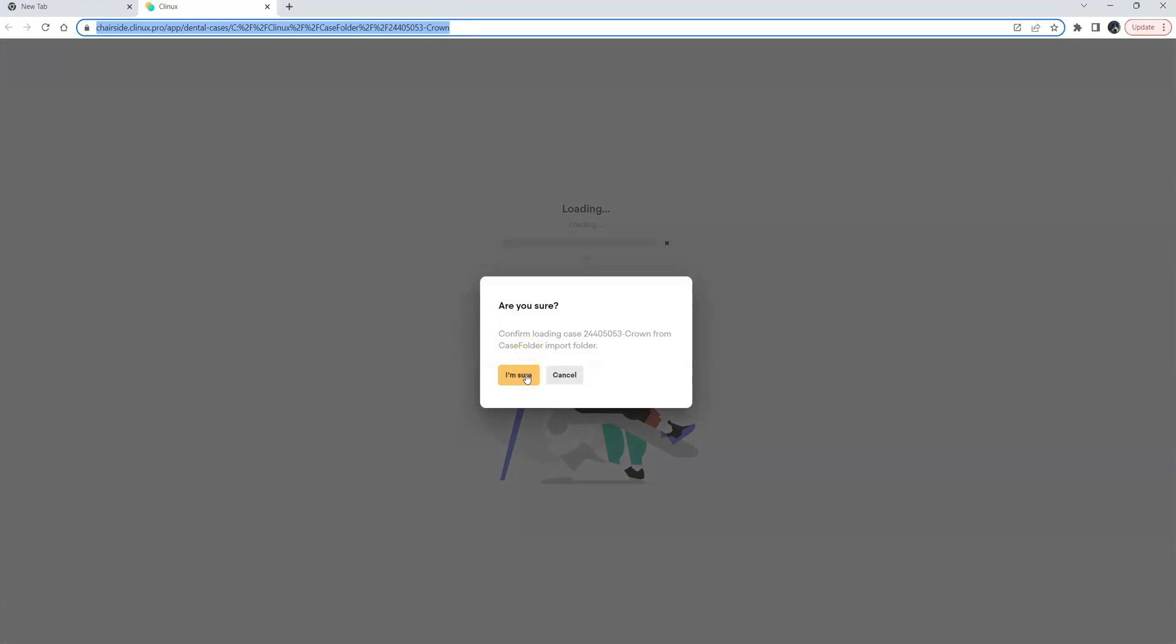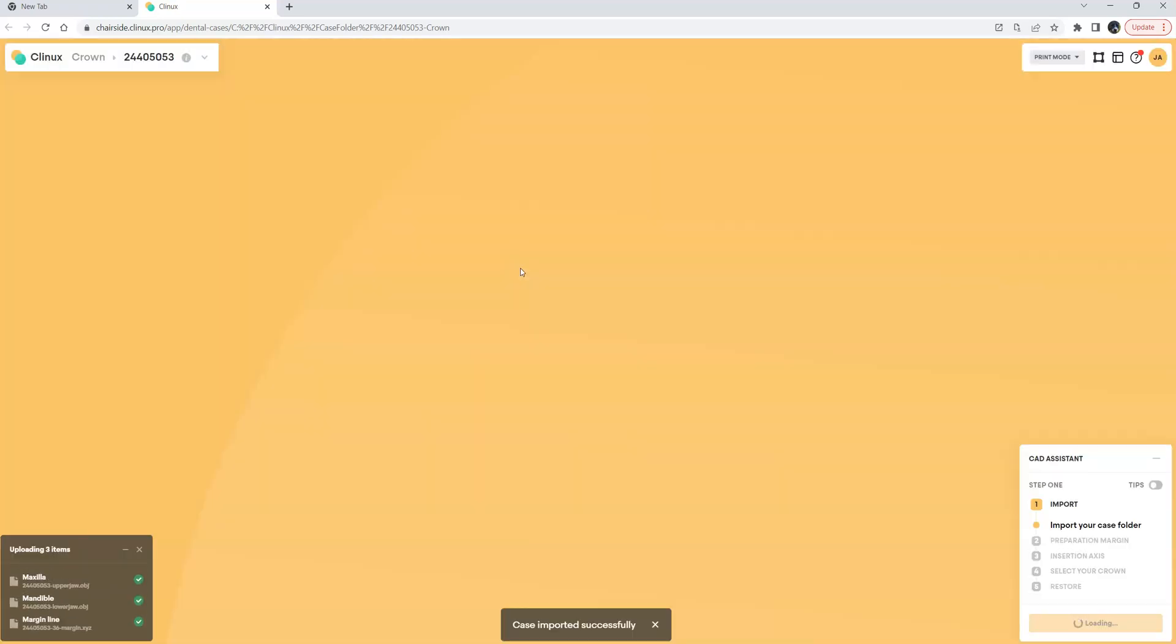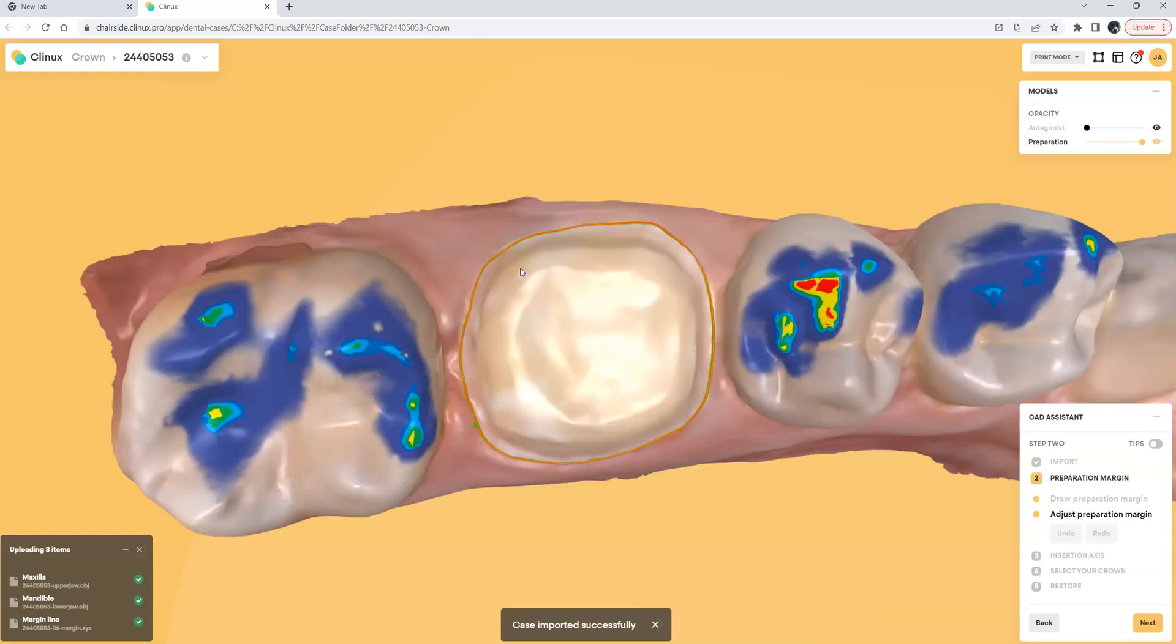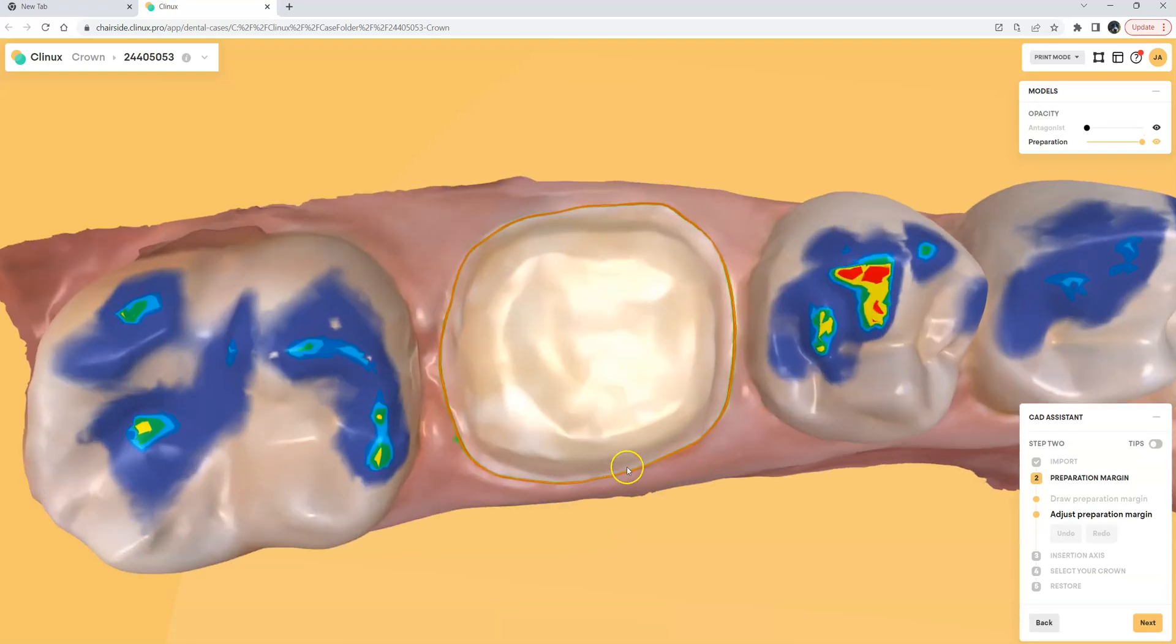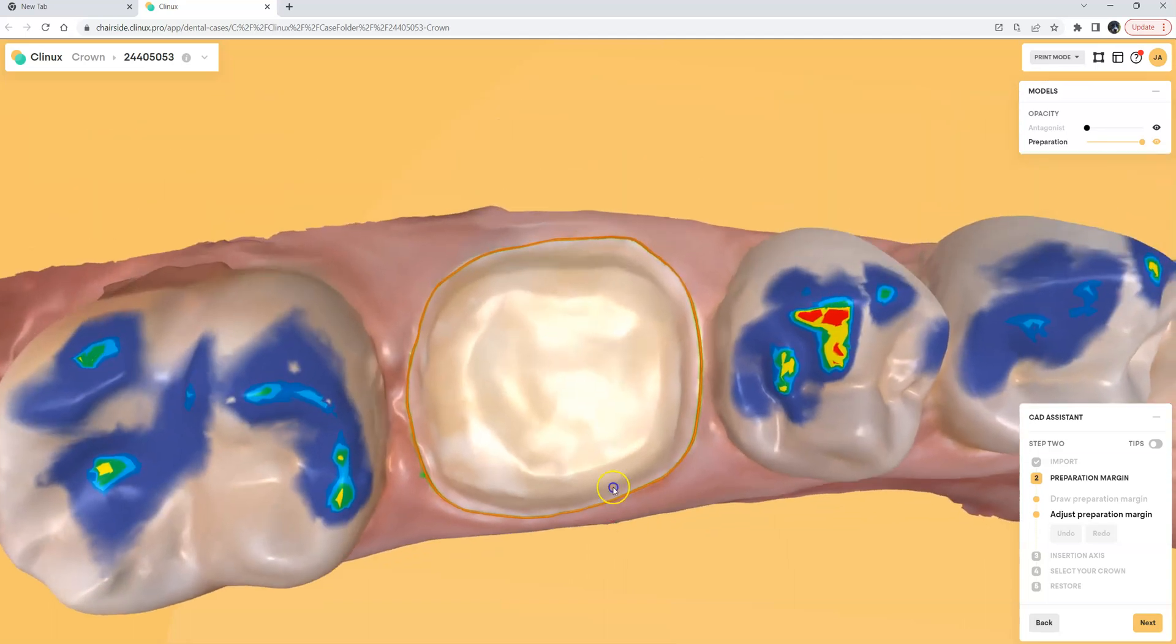It'll prompt us to ask us to be sure that we want to load the case. We can click these two little security buttons for Google Chrome and within a matter of seconds the models will be brought into the Clinux web-based app with the margin line that we drew in MeditLink already in there.